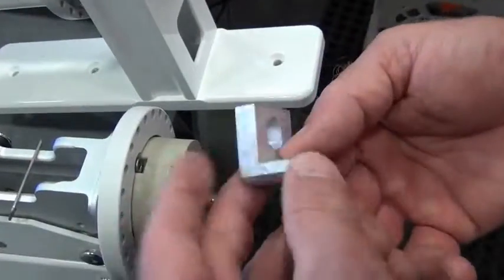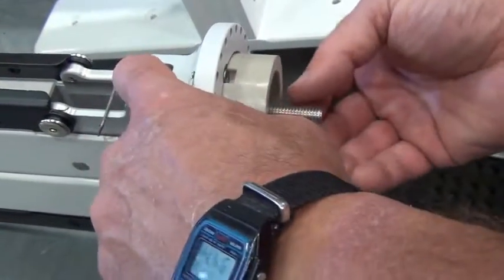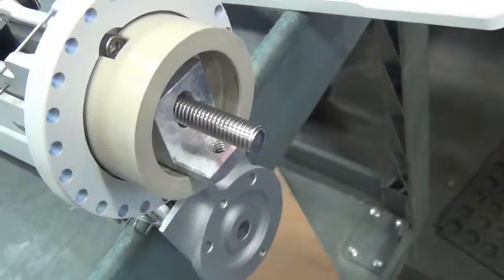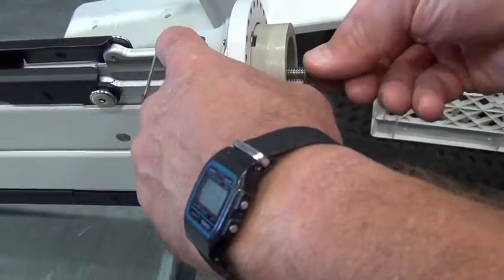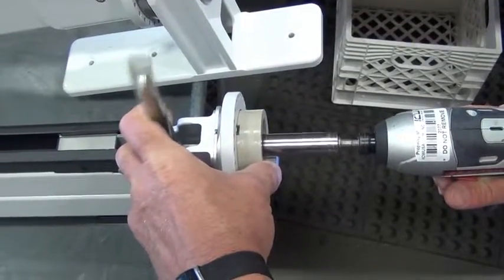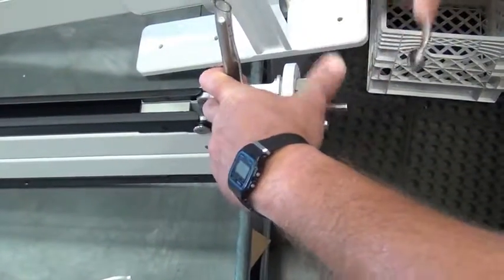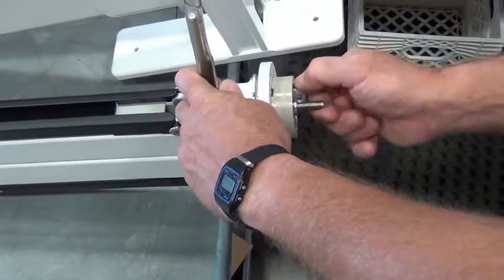The anti-drift block slides over the bolt. A 3/8 inch stainless steel washer and a 3/8 inch nylock nut slide over the bolt. The nut is tightened down, then backed off a quarter turn so the block can move. The anti-drift block prevents excess movement at that joint.